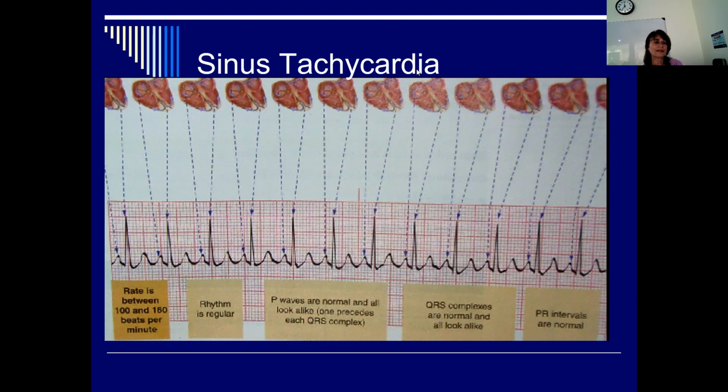All right, so when you look at this, if you say, oh, look, there's 2 P waves. Before you can call this a P wave, it has to come after the T wave. So you see the T wave first, and then anything that follows is a P wave. So that first upward deflection is your T wave, so QRS, T, and then the next wave would be a P wave. Is the PR interval normal?